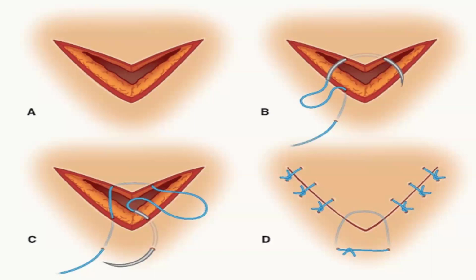So from this point, you will insert under the skin. You will go inside the wound. Clear? This, the apex. You will insert from this 1 centimeter, 1 centimeter under the skin. Clear? Number three, you will go from inside the wound to this point again, under the skin. Once you do the tie, it will be closed like this. Easy? So 3 times.